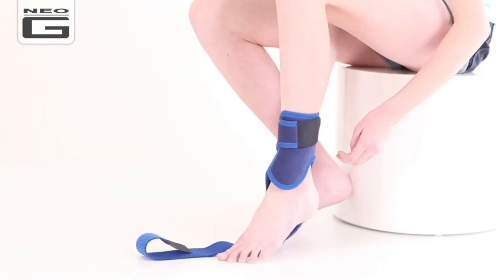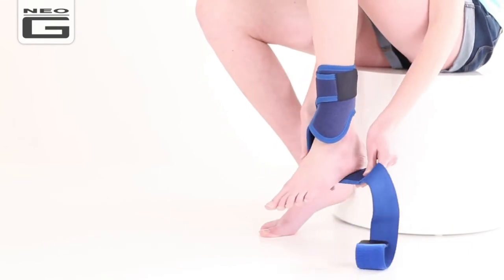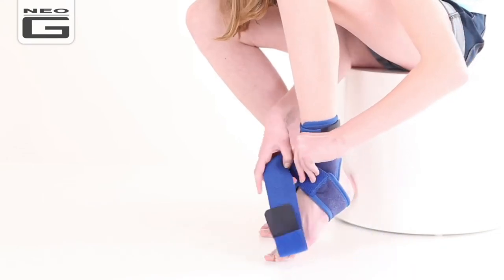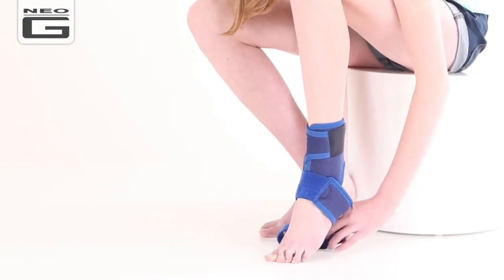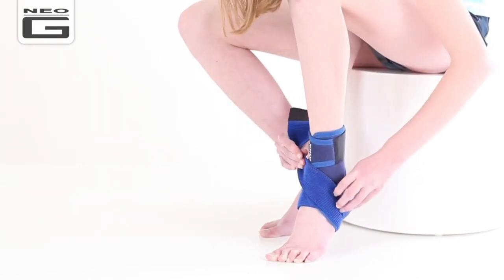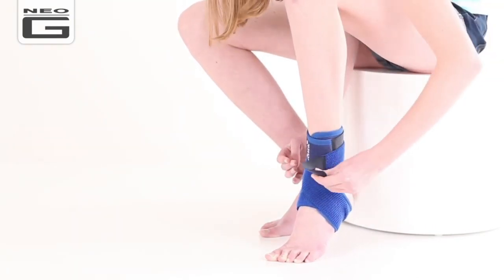Wrap the long strap over and under the foot and continue to pull the strap across the front of the foot and behind the ankle in a Figure of 8 motion. Continue to pull the strap over the front of the foot and secure the fastener onto the front strap and adjust until firm yet comfortable.